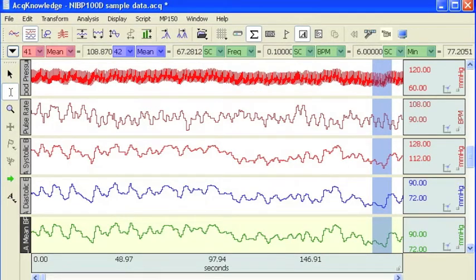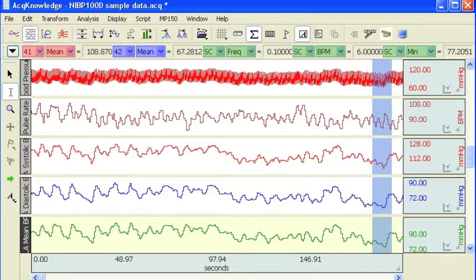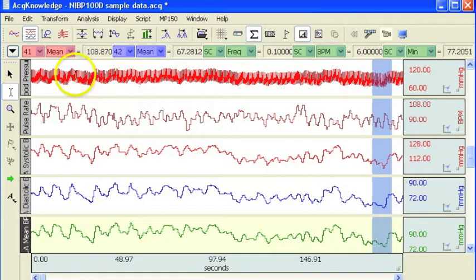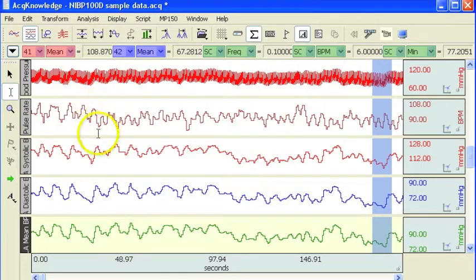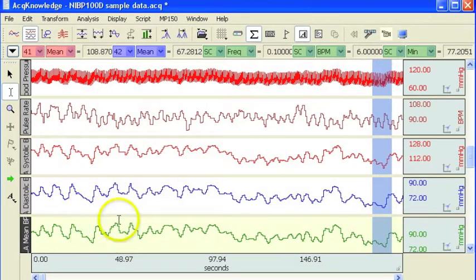It's particularly useful when you've got many channels of data and you want to take several different measurements. In the sample file that I've got open here, we've got a blood pressure waveform with heart rate, systolic, diastolic and mean pressure measurements.